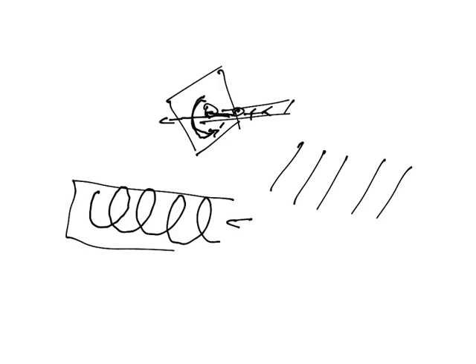And so now they take this data with their computers and are able to, again, get the same type of image. You get the full body depiction, three-dimensional. But now the process is very quick. You can do a full body scan in about 30 seconds, from head to toe, and get a complete 100% representation, three-dimensionally, of the inside of the body.